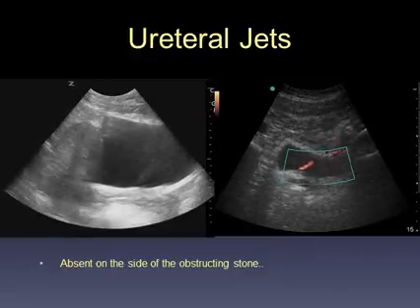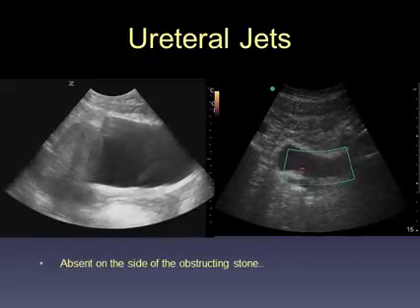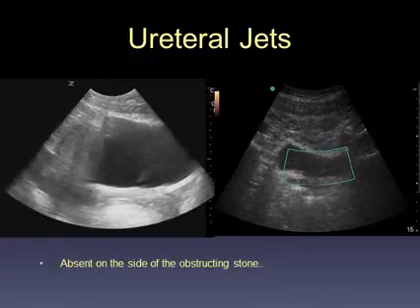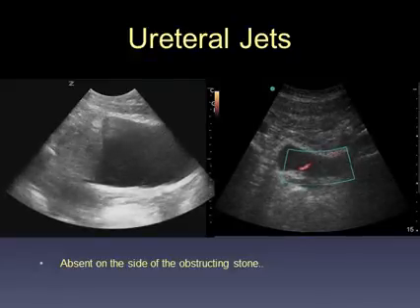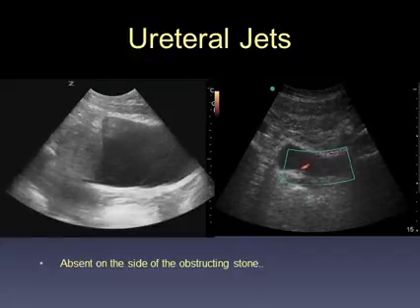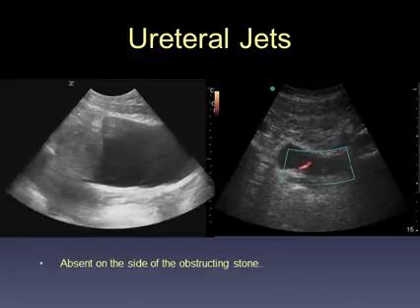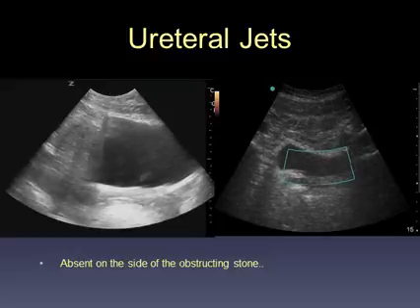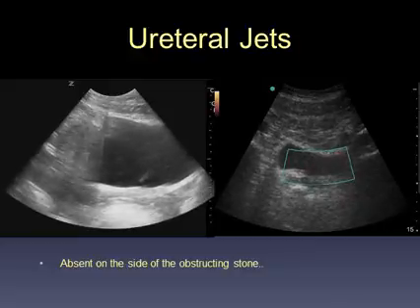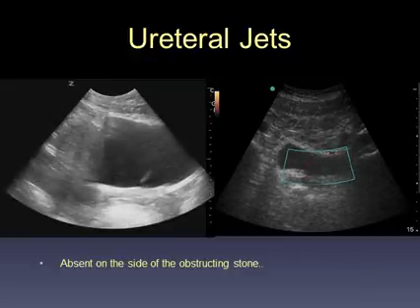It warrants pointing out that the literature tells us these ureteral jets can be quite infrequent, somewhere between 5 and 15 minutes in their cycles. In some patients they can be more frequent than that. What this means practically is that unless you stand there for 15 minutes, you can't completely declare a ureteral jet as absent. So for our purposes, in confirming stone diagnosis, or rather excluding it, we can't say that the absence of a jet makes it more likely to be a stone, unless we're prepared to stand there for 15 minutes, but we can say that the presence of a jet on one side is an indication that there is unlikely to be a blockage of the ureter on that side.